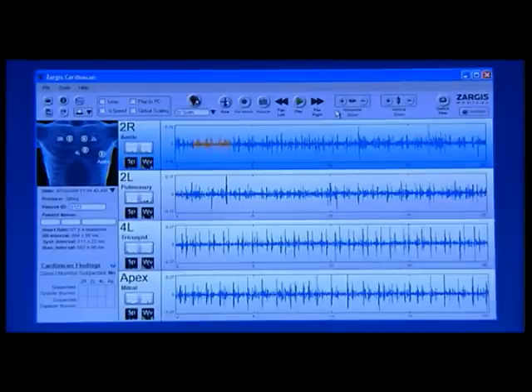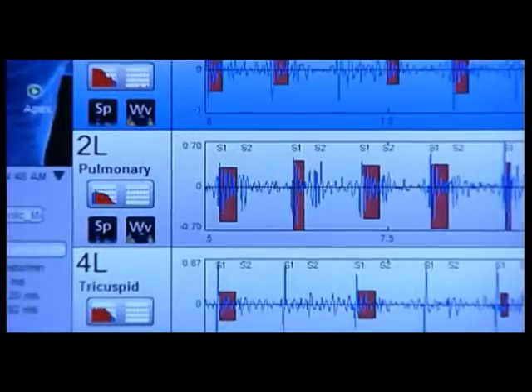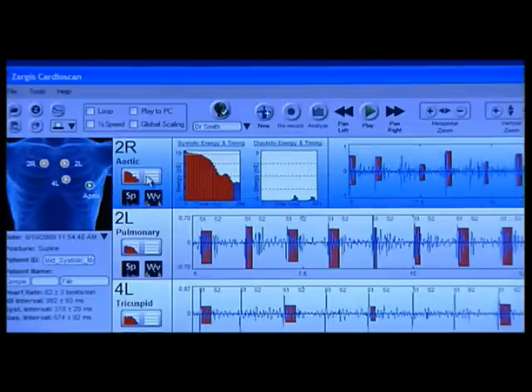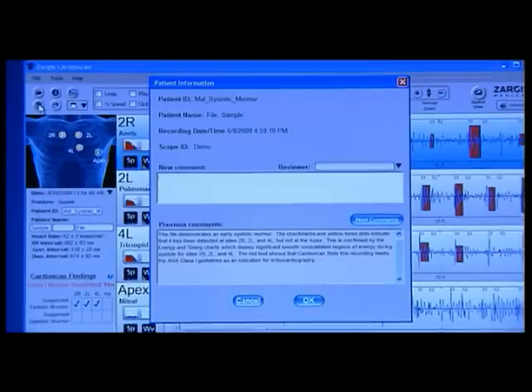This will launch the Zargis CardioScan software detailed view screen. Many additional options appear on the detailed screen to view and listen to the recorded sounds. As on the summary view screen, S1 and S2 markings are present for each recording. To launch the systolic and diastolic energy and timing graph for a site recording, click the rectangular icon that appears under the site name. These graphs display the energy, timing, and shape of murmurs. Under this button are the spectrogram and wavelet icons that allow you to view the recordings in the respective graphs. You can enter and or view past comments associated with this sound file by clicking the Patient Information button located at the top left of the software screen.